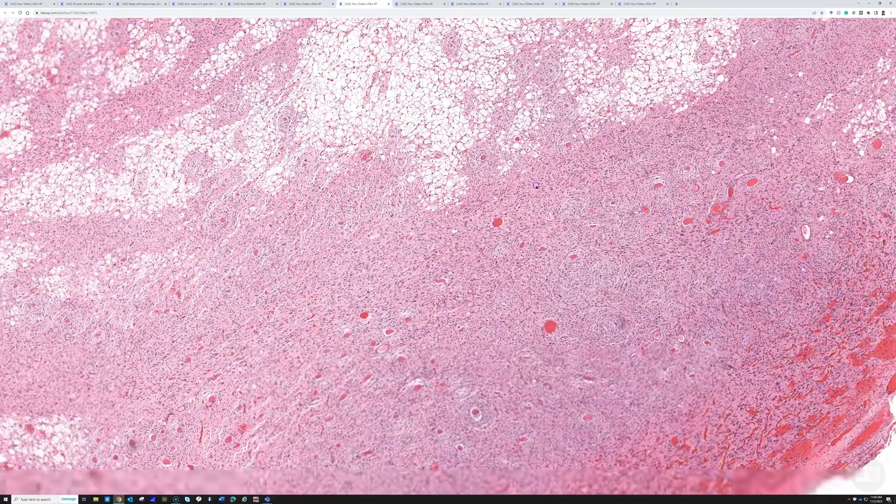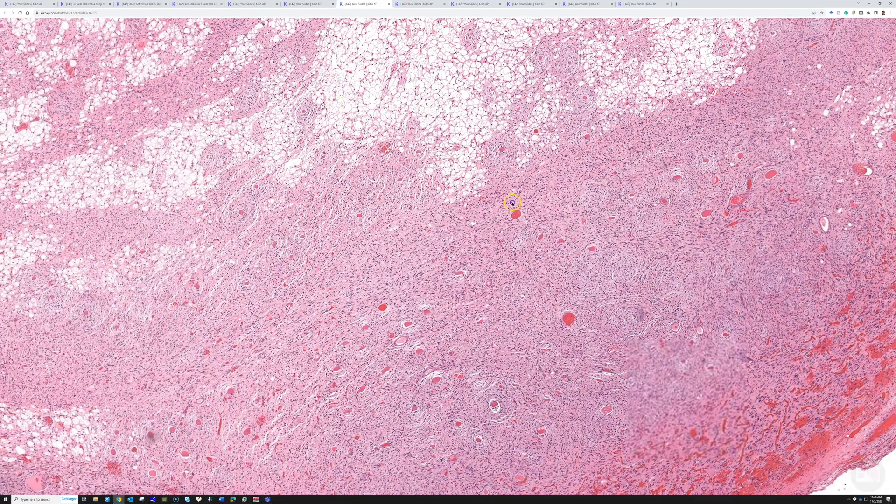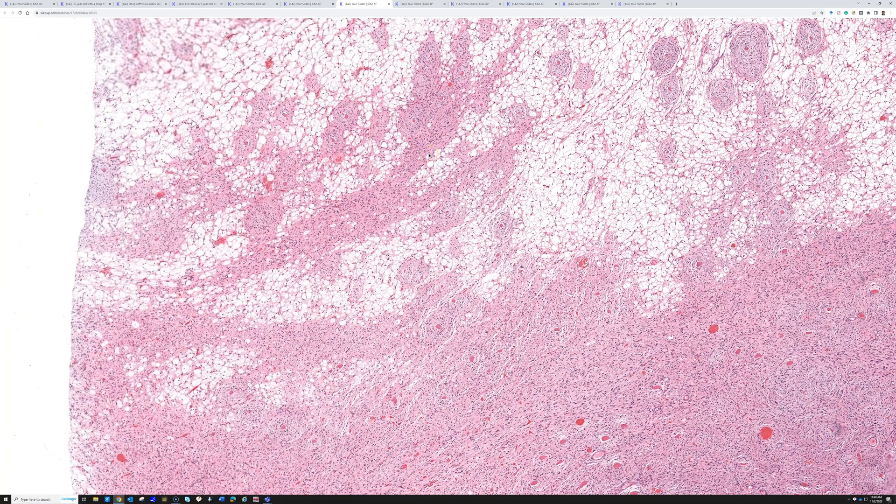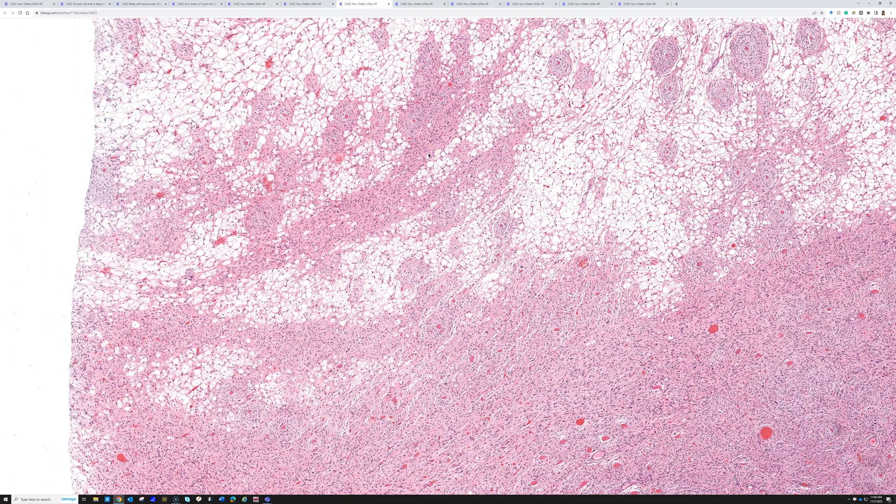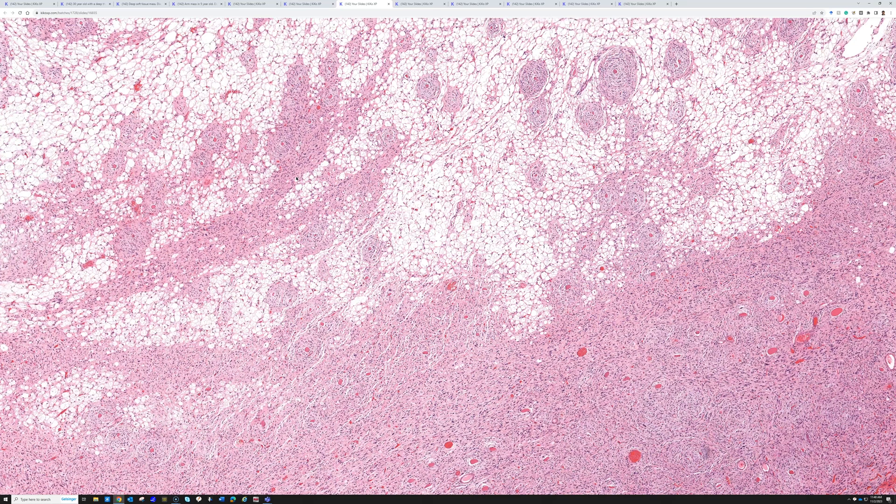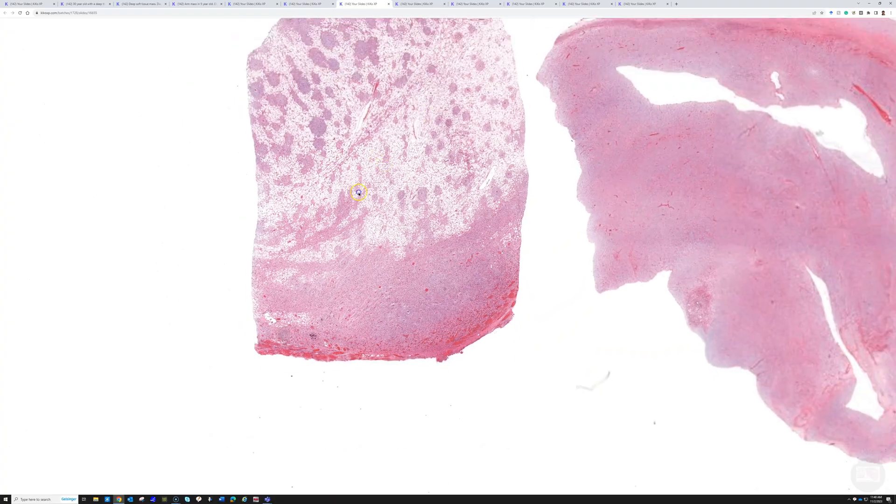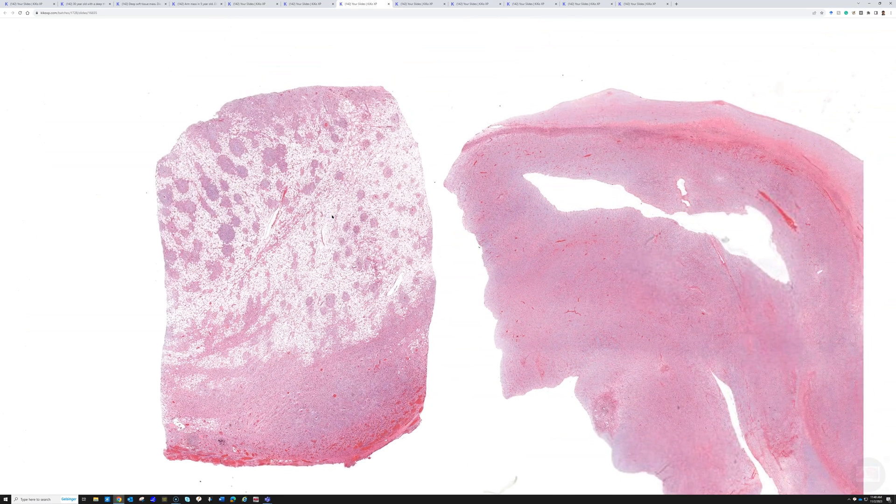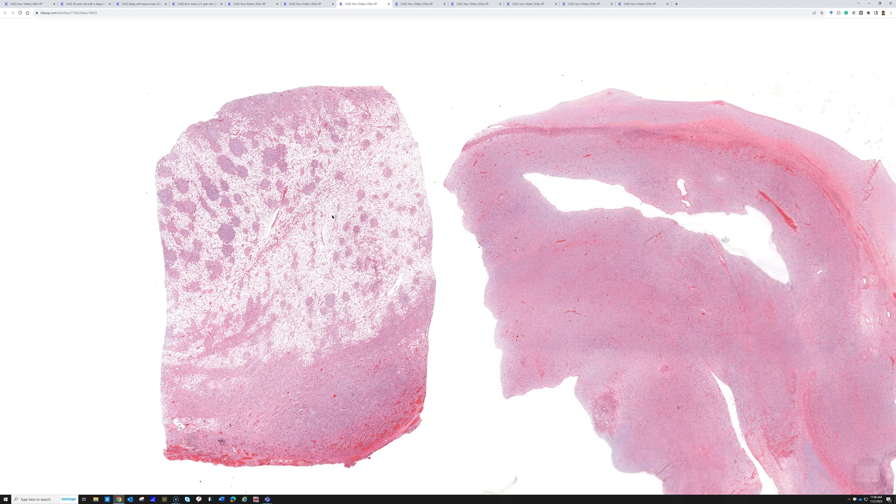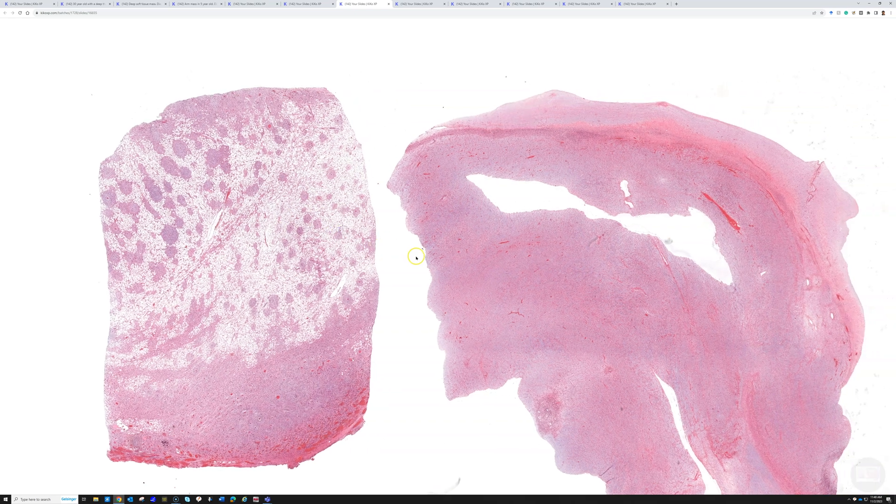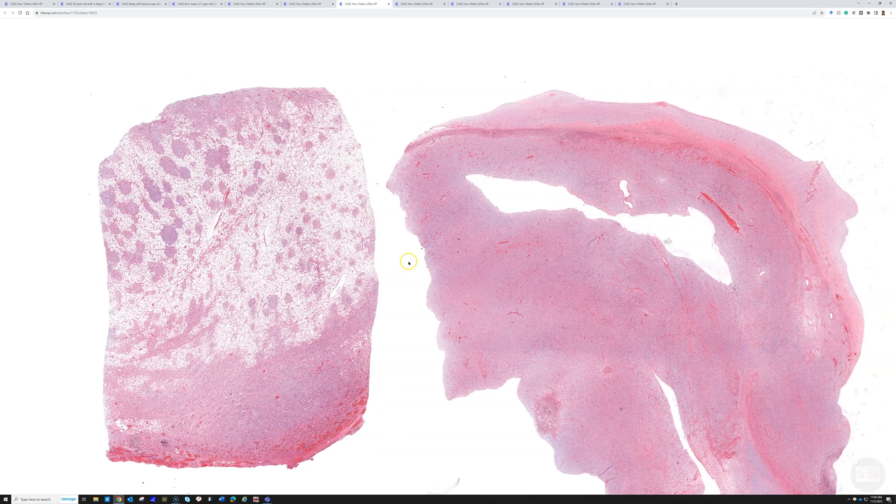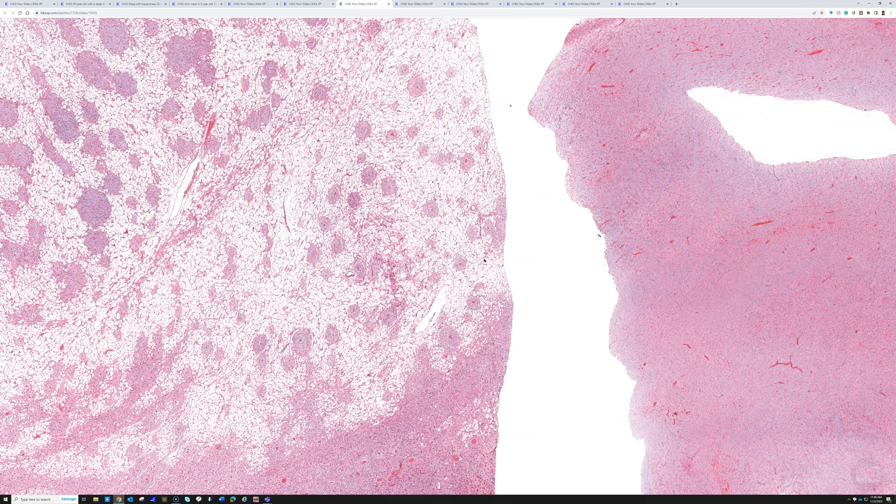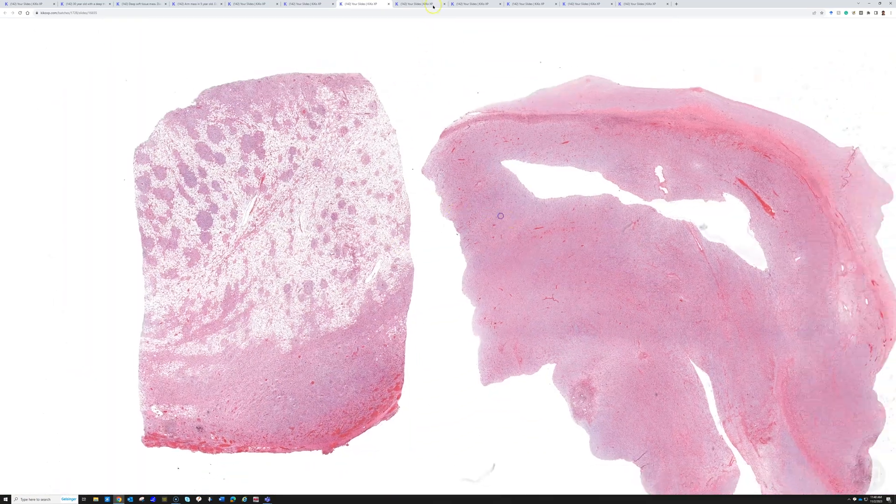Just enjoy all these morphologic patterns for the sake of their interesting nature, but also remember that any sort of tumor you see in the retroperitoneum, always keep de-differentiated liposarcoma in your differential diagnosis. If you're having difficulty, you can do testing for MDM2. I prefer using FISH, but some people use immunohistochemistry. Just be careful that you can have false positive staining with immunostains. You can use molecular testing for MDM2 amplification to help support the diagnosis on a small needle biopsy or in difficult cases.